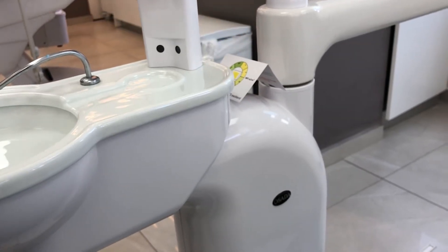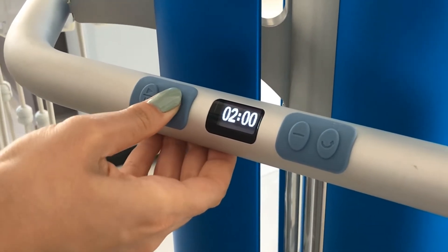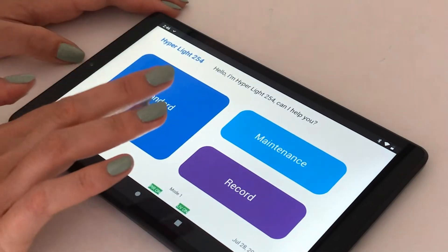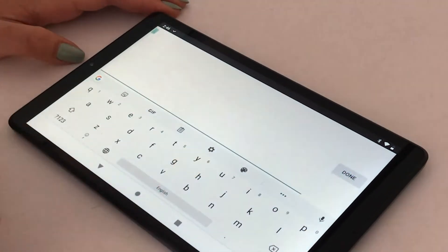The device can be programmed using the control buttons on the device's circumferential control handle, and after activation we can leave the room, or we can otherwise program the device remotely using the included tablet, which also allows us to document and control the disinfection process.